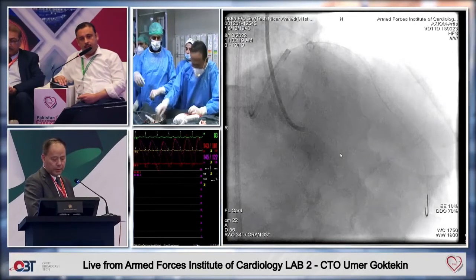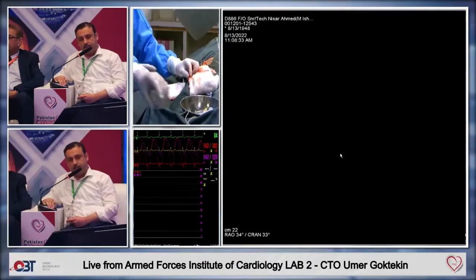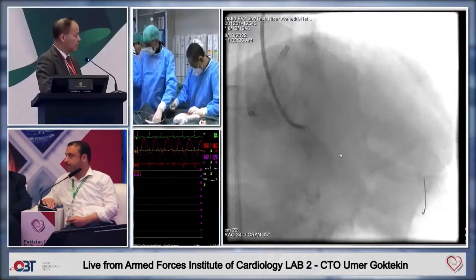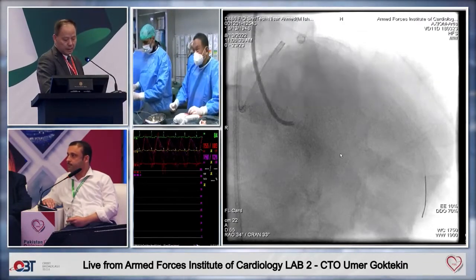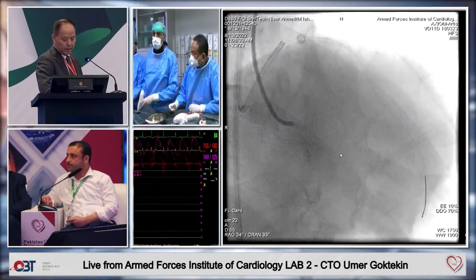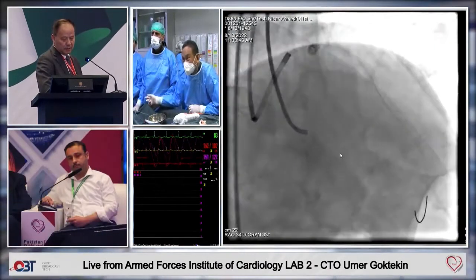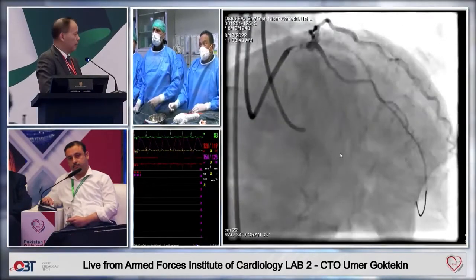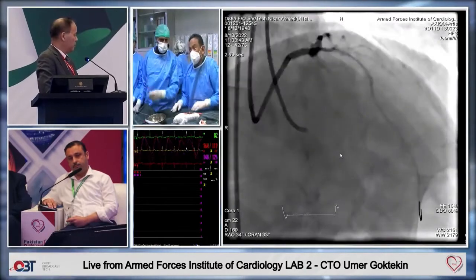So Dr. Rosalie, do you plan to... We now have the Corsair Pro Access, so that is no problem. Injection, left. Okay, we're going to give an injection for you on the left side. Do you plan to check IVUS? Left. Yeah, I need to ask all my panelists. Do we need the right?